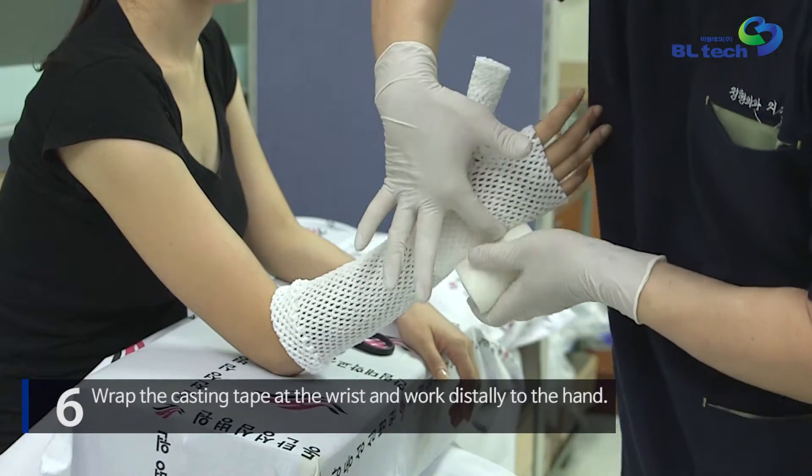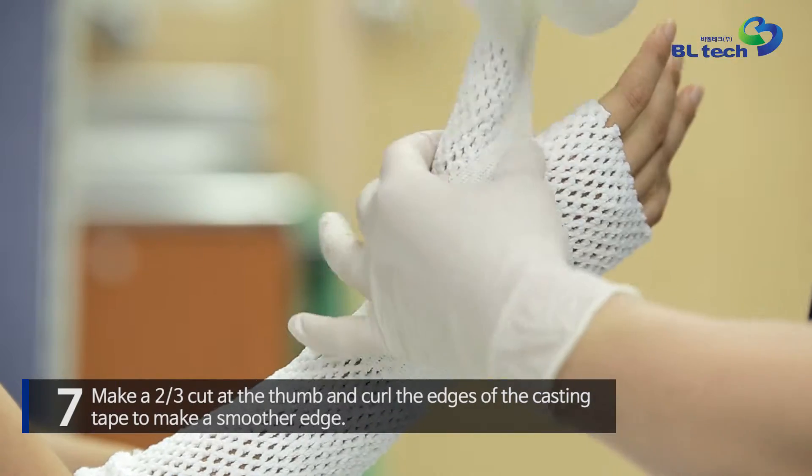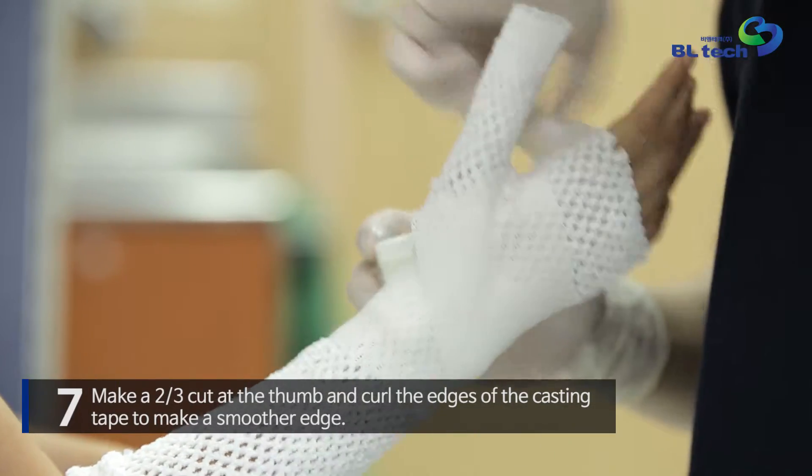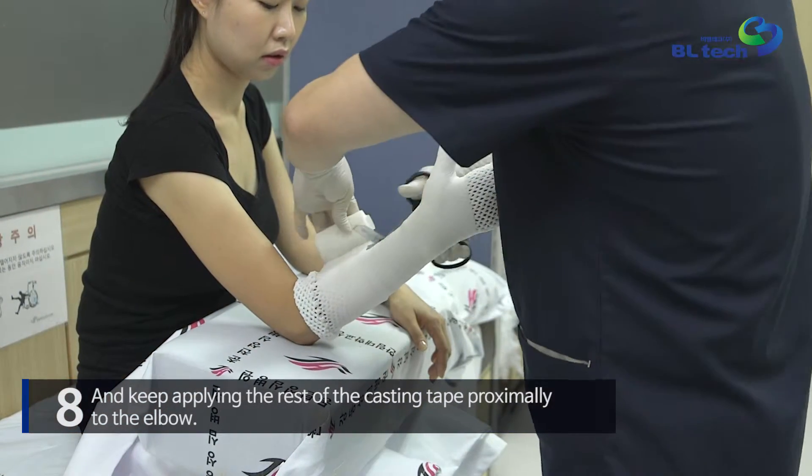Wrap the casting tape at the wrist and work distally to the hand. Make a two-thirds cut at the thumb and curl the edges of the casting tape to make a smoother edge, then keep applying the rest of the casting tape proximally to the elbow.